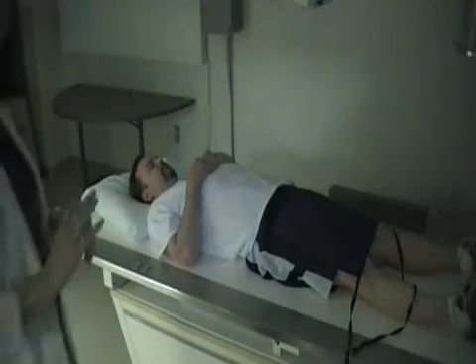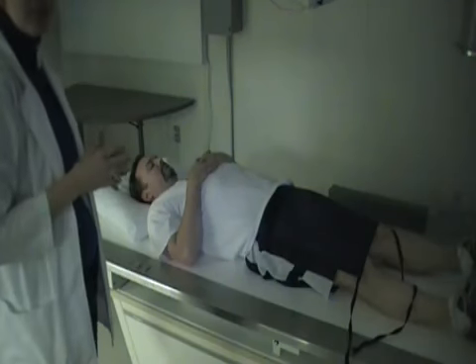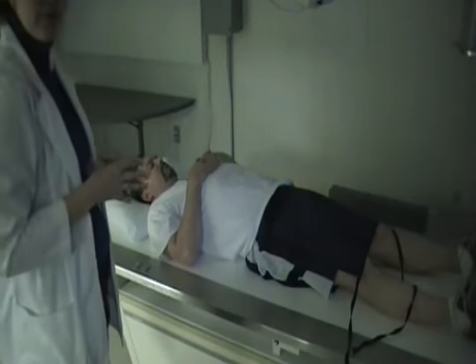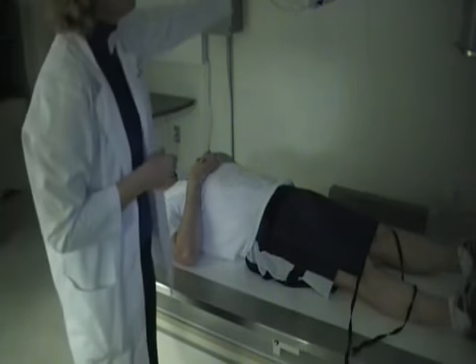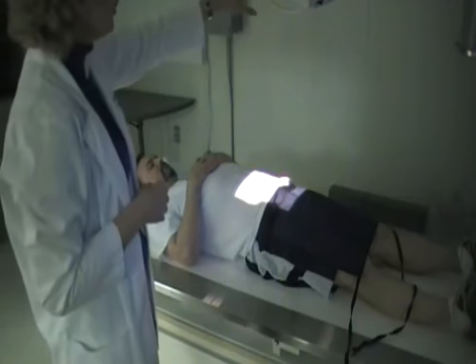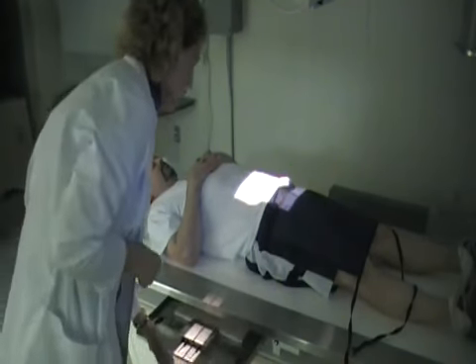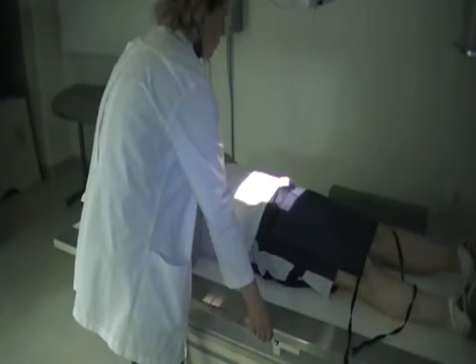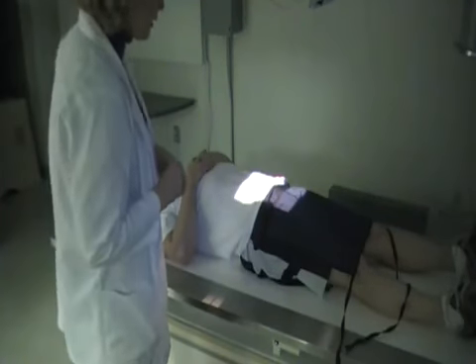Okay, next we're going to do some imaging on the sacrum and coccyx. Now, for this you need to use the smaller image receptor, the 24 by 30 centimeter or the 10 by 12. For the sacrum, you're going to have a 15-degree cephalic angle on the tube. So, set your angle, adjust your bucky so that it is centered, and then you're going to have your central ray enter 2 inches above the pubic symphysis.